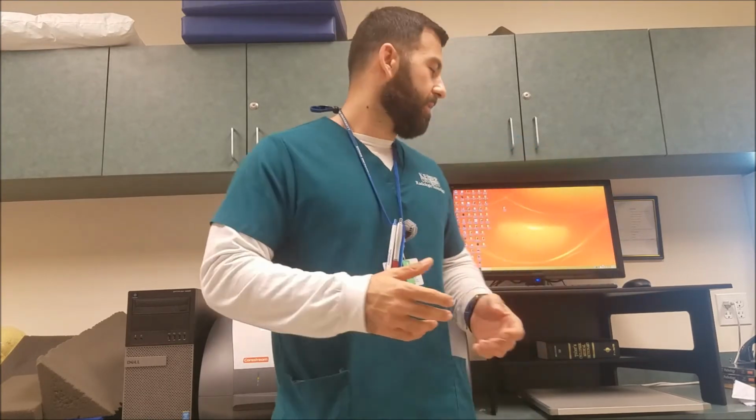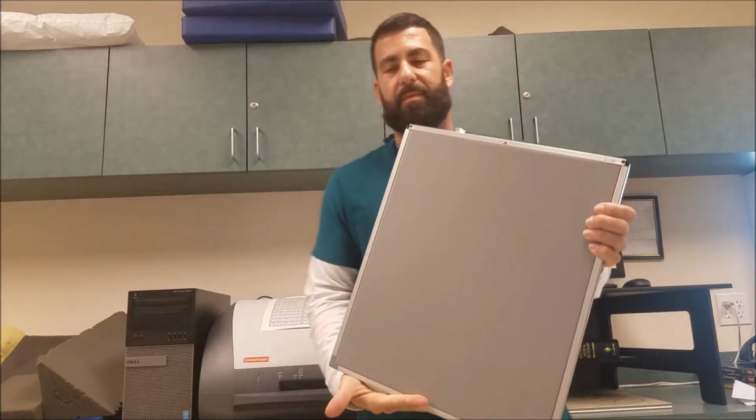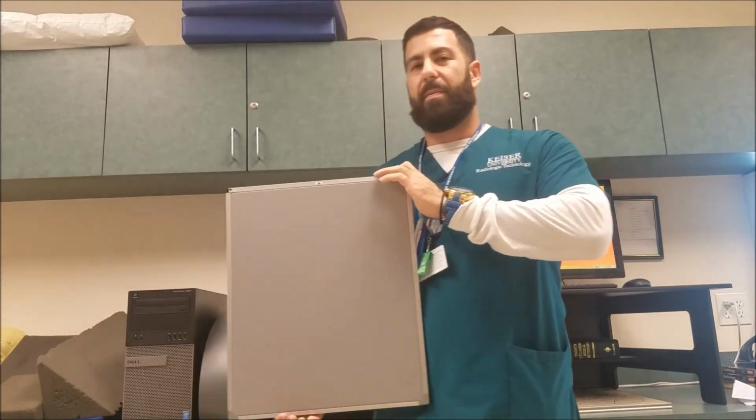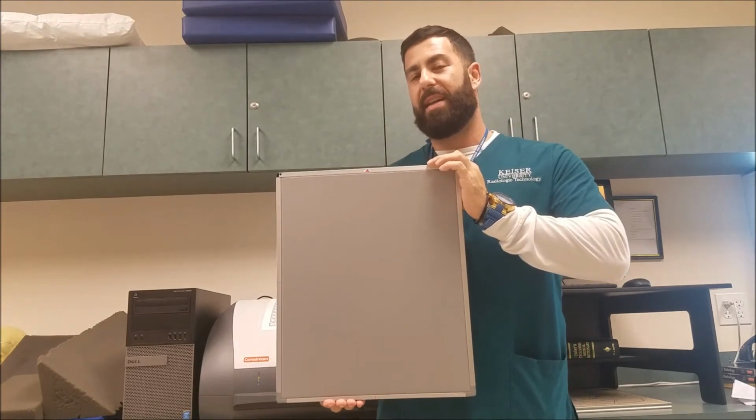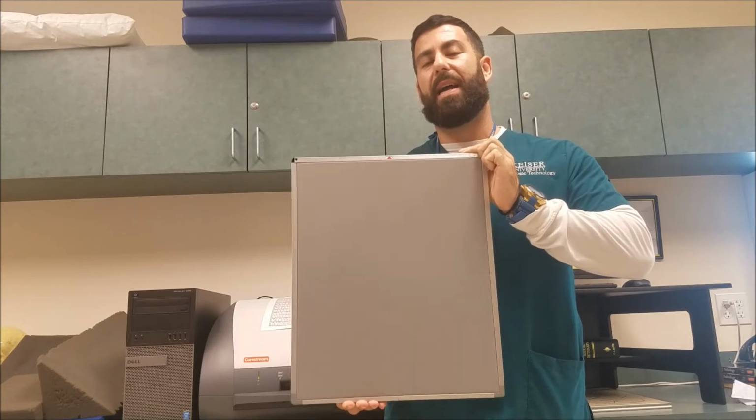Moving on, I'm now going to speak about computed radiography, also known as CR. CR uses cassettes very similar to film, but instead of having film inside, it has an imaging plate, also referred to as an IP.